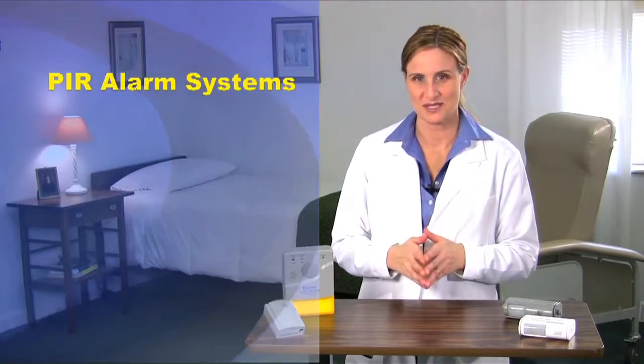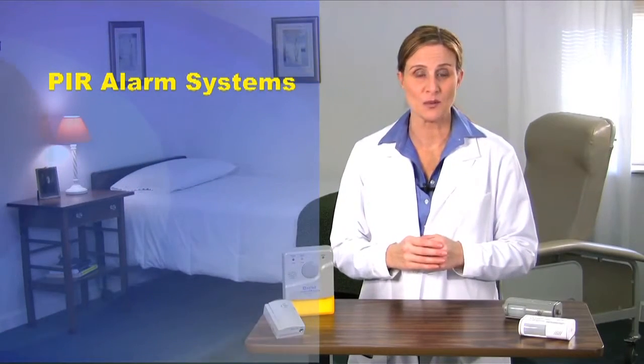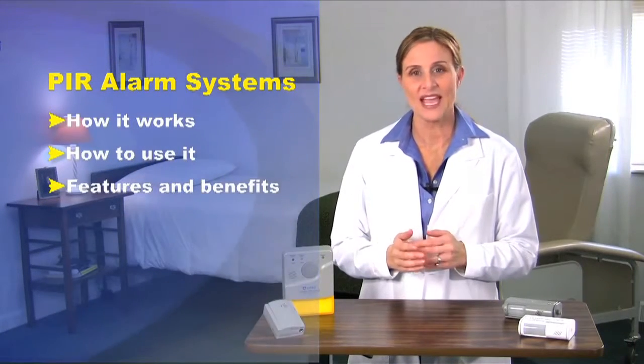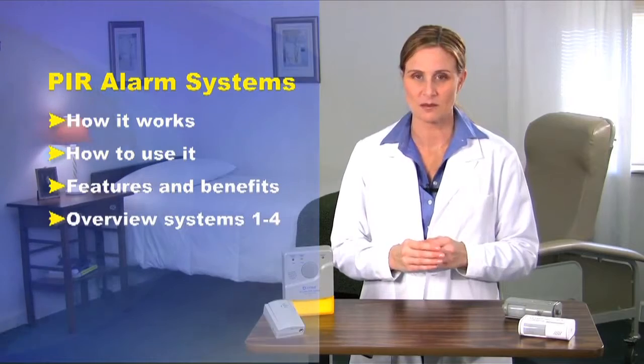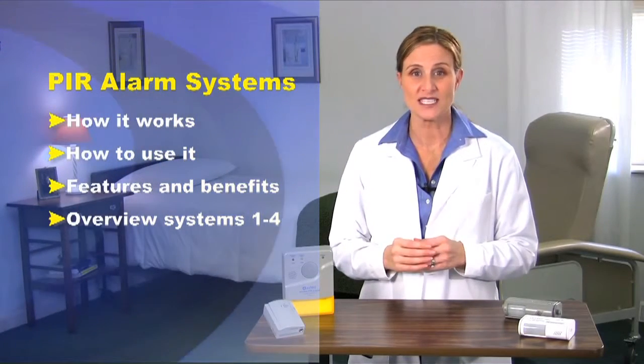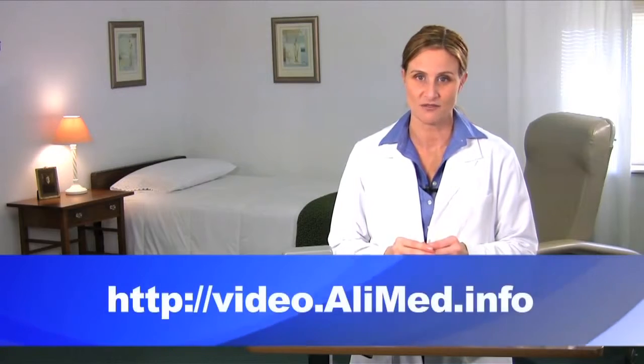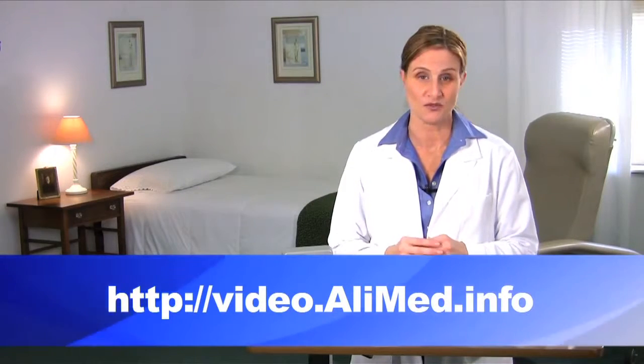Join me now for an overview of the PIR fall alarm systems. The overview will explain how it works, how to use it, all the features and benefits of the system, and we'll overview the four other available PIR system variations. For more details on each of the four alarm systems, you may view a separate video on each. You may find these videos at video.alimed.info or in the chapter menu if you're viewing our DVD.